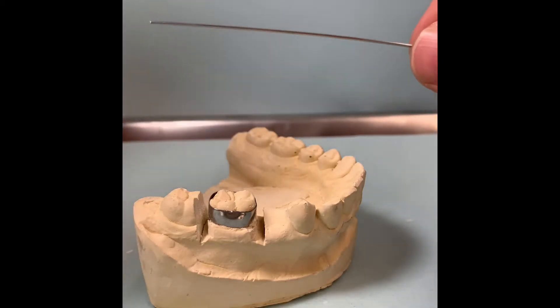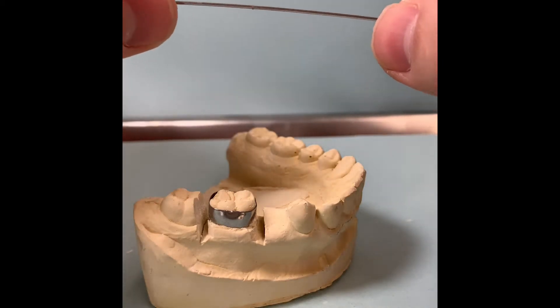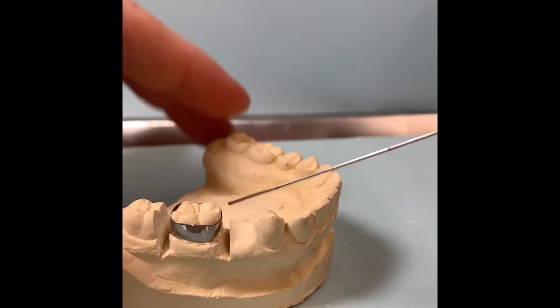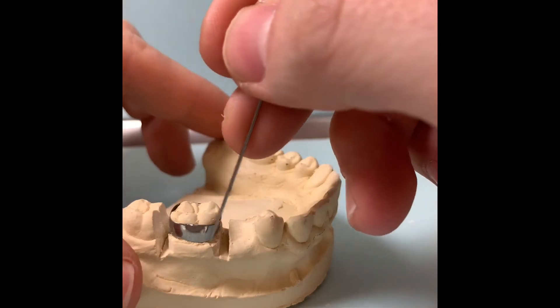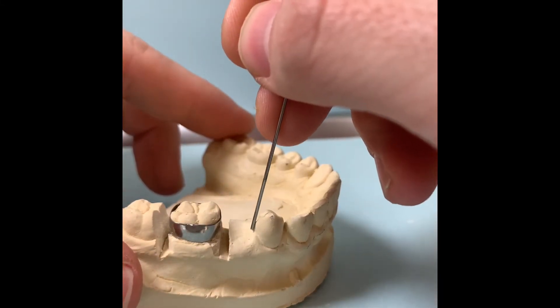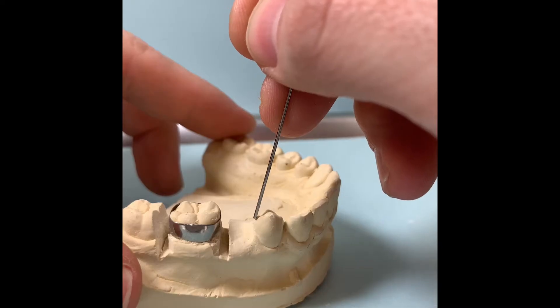We're going to take about a 3-inch piece of wire, 032. The main thing is we want to wrap around the band on both sides, and then we want to make a little loop, and make sure it contacts at this adjacent tooth.